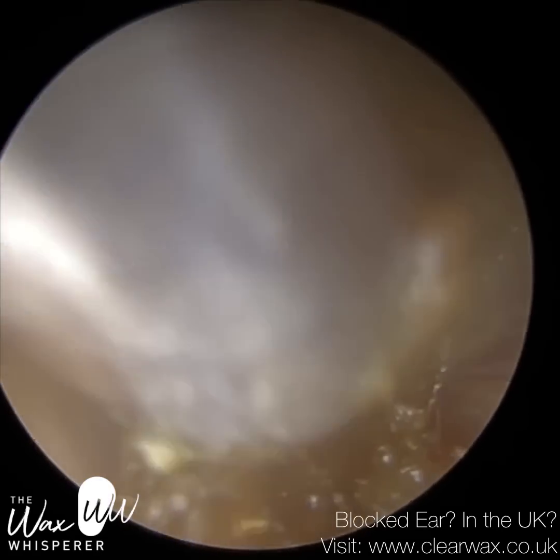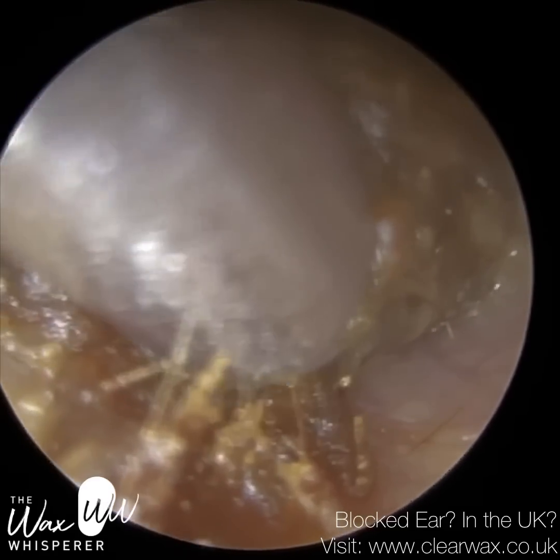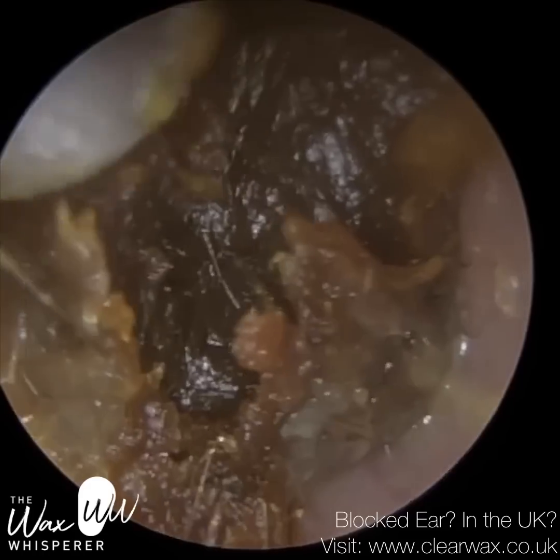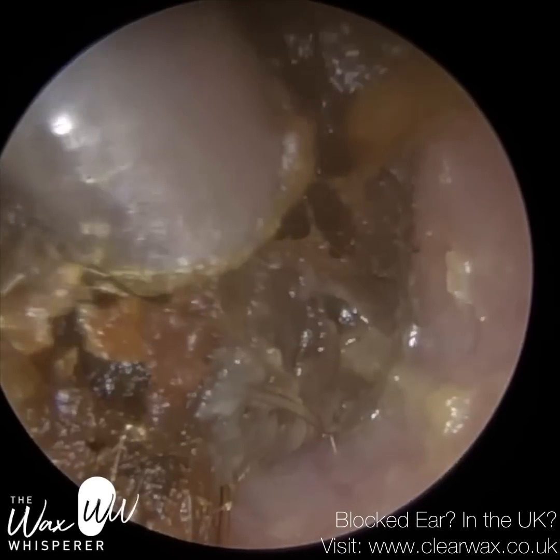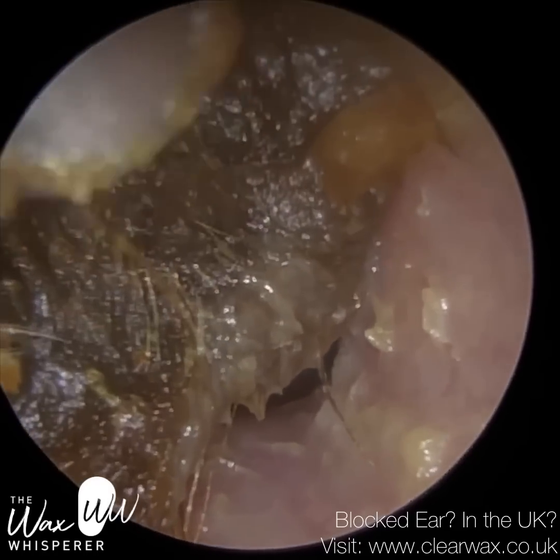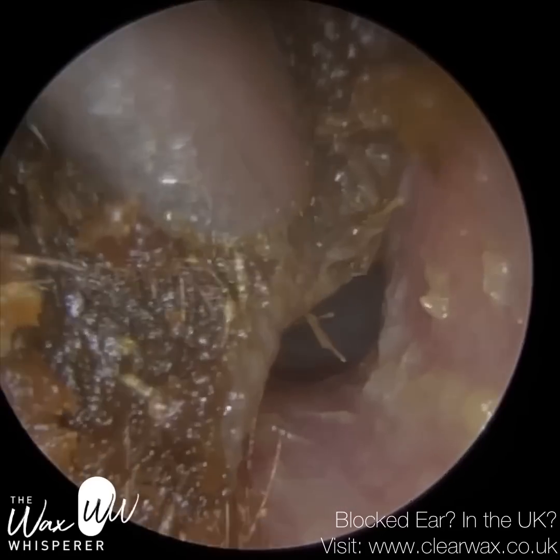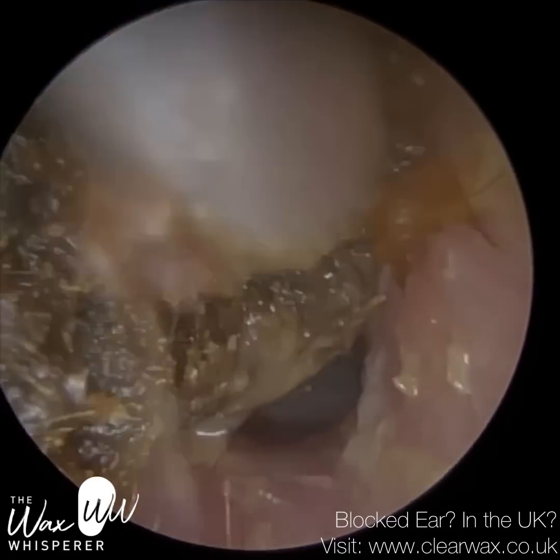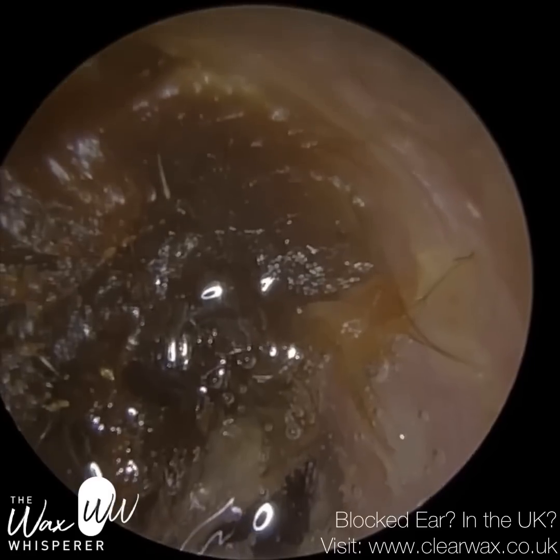After removing the right ear, clearing this ear, we also proceeded to remove the wax from the left ear. They've been using some sodium bicarbonate drops the day before, which would make the wax slightly mushy and sticky, as you can see. What the sodium bicarbonate drops does is, as it enters the ear, it reacts with a carboxylic acid, which is secreted by bacteria that feed on sebum. Sebum is an oily, fatty secretion found not only in our ears but also on our scalp, and it's produced by sebaceous glands that attach to the hair follicle.